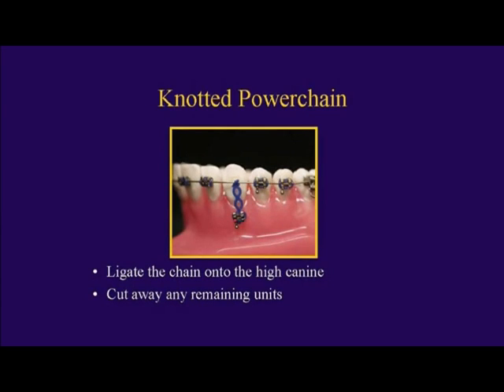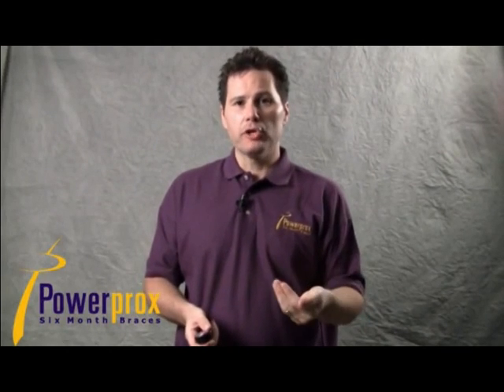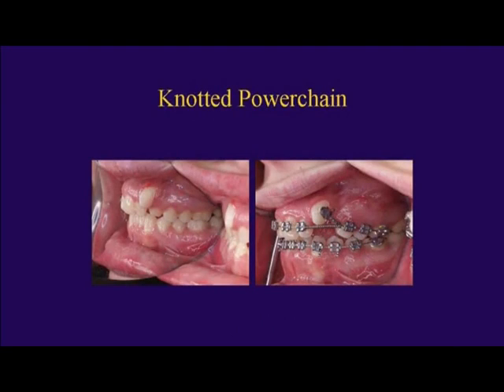Now you have knotted the power chain onto the arch wire. Now just take that power chain and stretch it on up to the canine, put it on, and cut off any extra units that you may have. This is going to be a much safer way for you to bring that canine down. And here's a clinical case where we did just that. Now you can see in this case we have open coil spring. We have a wire that's bypassing the canine, open coil spring to maintain the space for the canine.